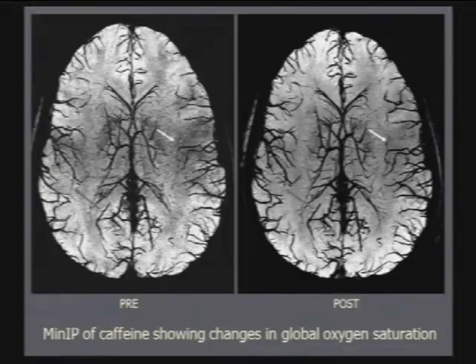Now, that's a little strange, because if you have reduced blood flow, why wouldn't I be seeing this caffeine effect? Well, if you have reduced blood flow and reduced blood volume, or reduced blood flow and brain tissue that's actually not functioning and not taking up the oxygen as it's supposed to take it up, in fact, the vessels, as you see them here, will begin to disappear. Now, this is actually in fairly good agreement with work by Yulin Gu from New York University, who spent the last 5 years demonstrating that there appears to be reduced perfusion to the brain in MS patients.